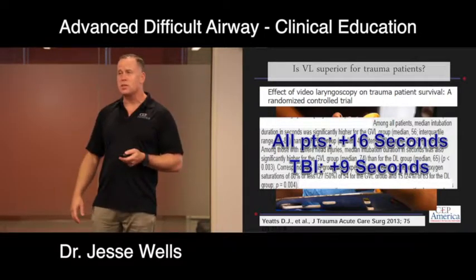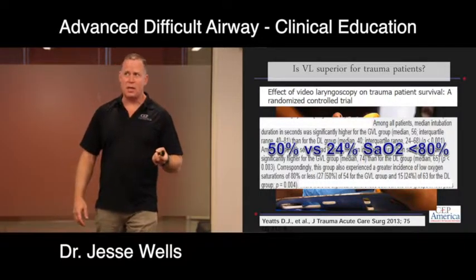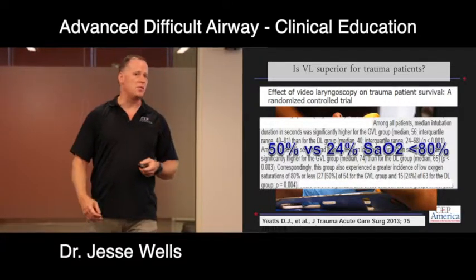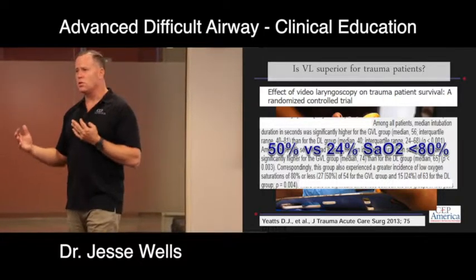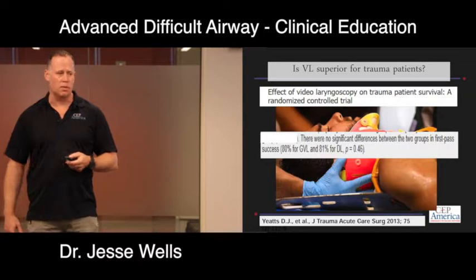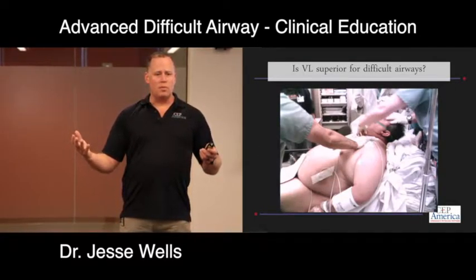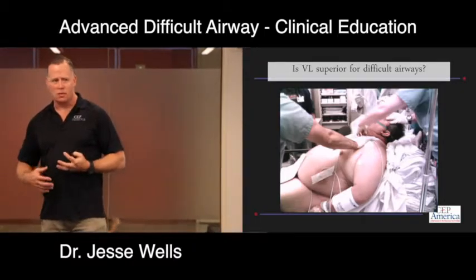And if you look at the SATs, basically 50% of the patients in the video laryngoscopy group had SATs less than 80%, versus 24% in the direct laryngoscopy group. So double the number of patients had SATs below 80 in the video versus direct laryngoscopy. And that ultimately was the difference. Essentially, the hypoxia resulted in a double mortality. Okay? So does that mean that we shouldn't use video laryngoscopy for trauma patients?